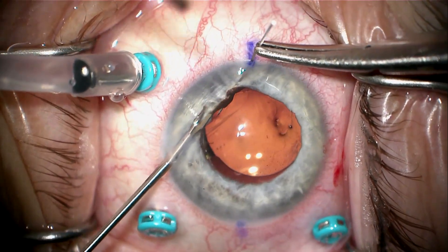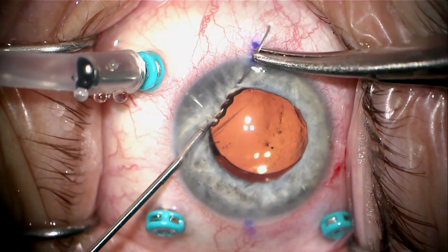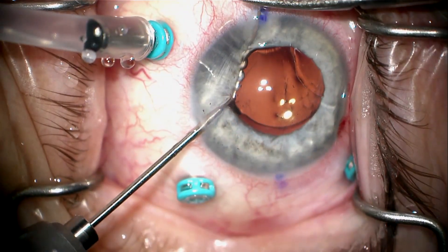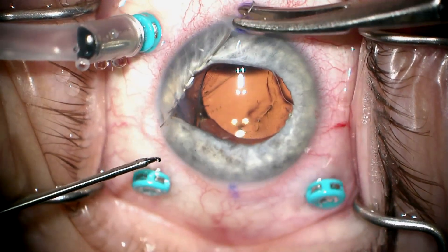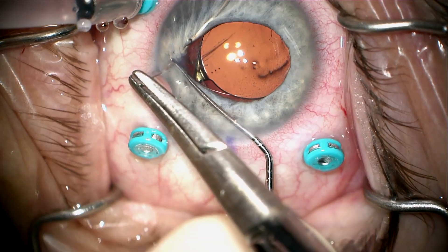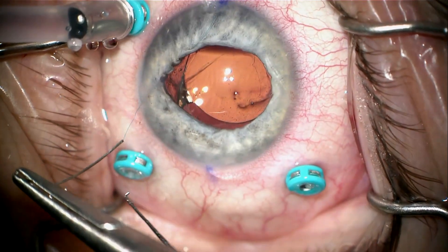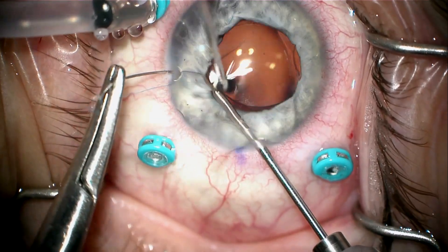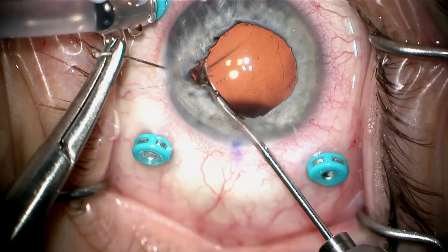You want to make these bites as close together as possible to get a nice, smooth, round pupil rather than one that looks like a starfish. After taking about six bites, I grab the tip of the needle and pull it out through a paracentesis 90 degrees away, holding the iris back as I pull the needle through. Otherwise the friction of the needle running through the iris will pull the iris out the paracentesis and traumatize it.